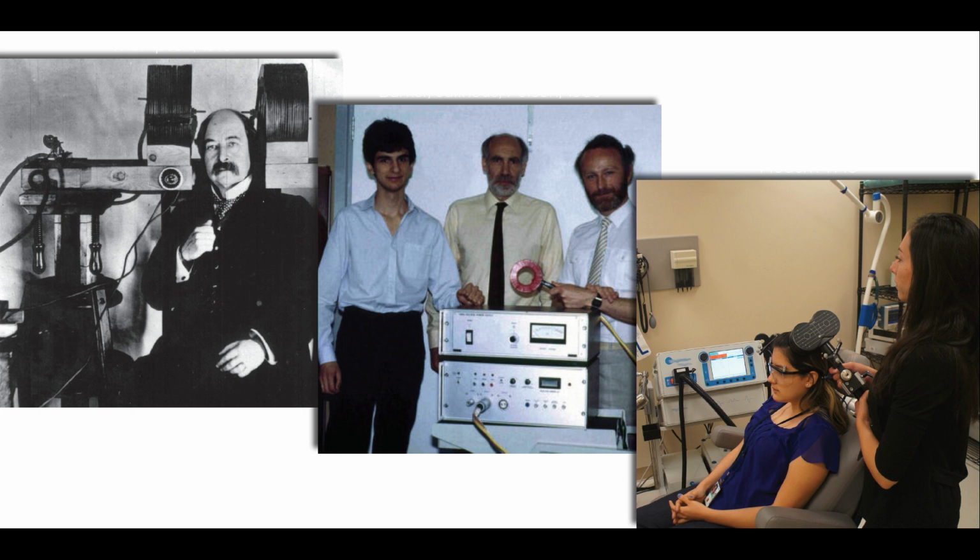And today, TMS is approved by the FDA for treatment of major depressive disorder and also OCD, a topic that you have learned from Dr. Lisenby earlier.